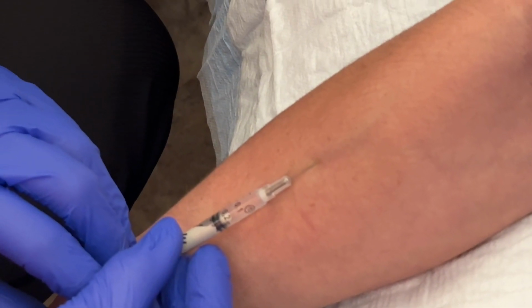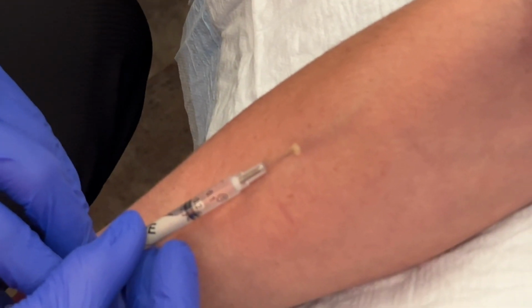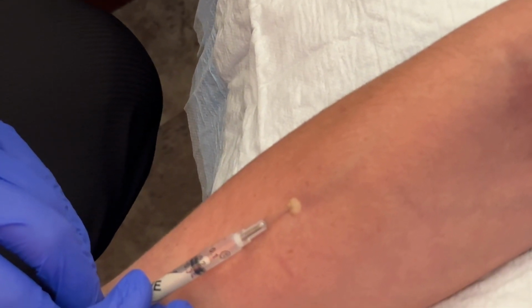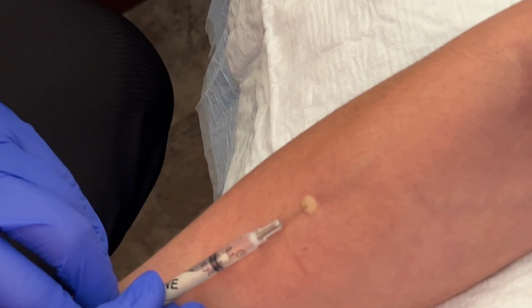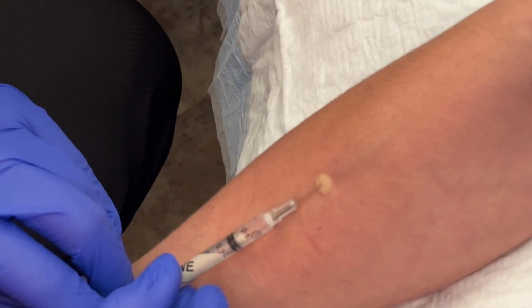I tell them sometimes you might feel a bee sting from this. I don't know why some people feel it. Some do, some don't. And I inject it pretty darn slow. If you inject too much too fast, or get too close to that vein, you can vasoconstrict it and lose your vein. So I usually inject about 1/10 of a cc there.